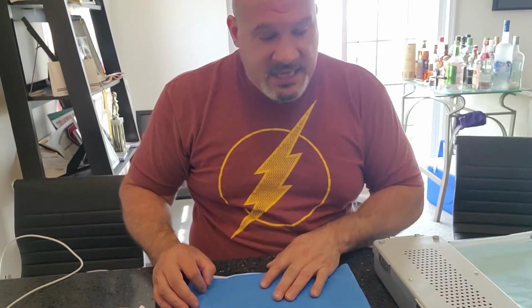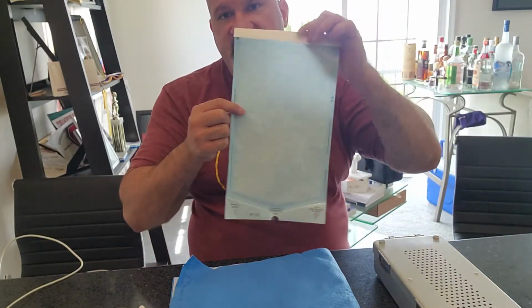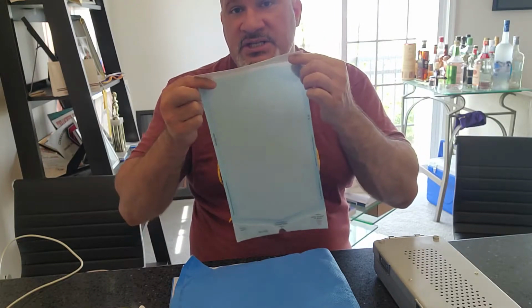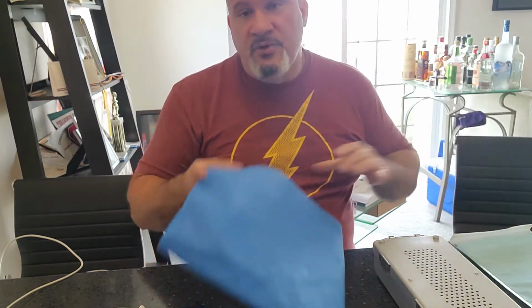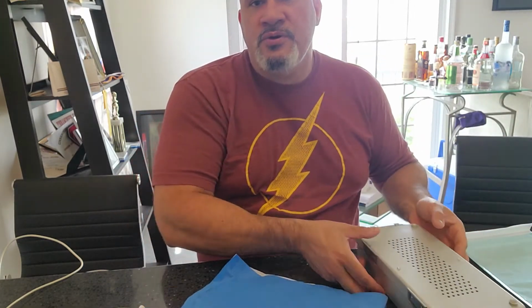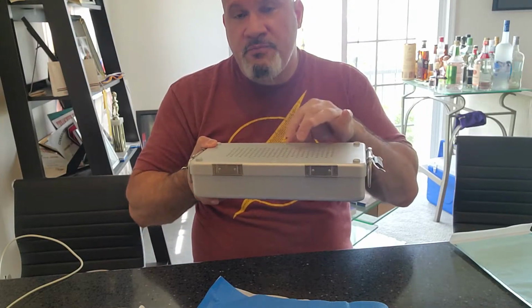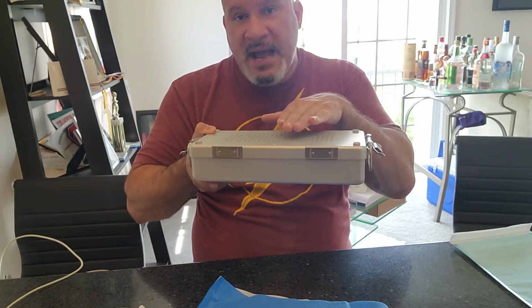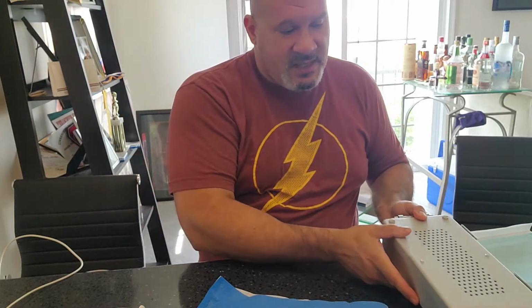The other thing is, does it fit in the packaging system? Of course, you want to leave a 1/4 inch margin around the seams when you're peel packing an item, okay? When you wrap, you don't want to wrap tightly, okay? And when you put in a container system, you want to make sure that whatever you put, the internal basket, that the items aren't seated above that basket and that the lid fits firmly and tightly, okay?